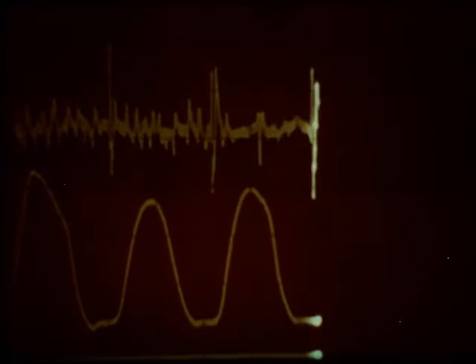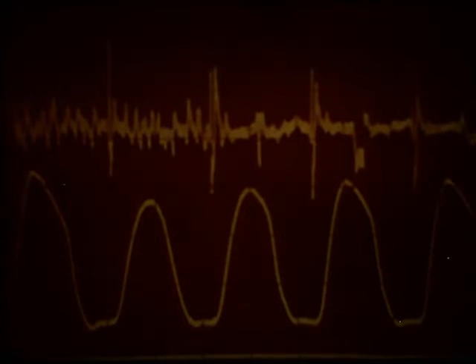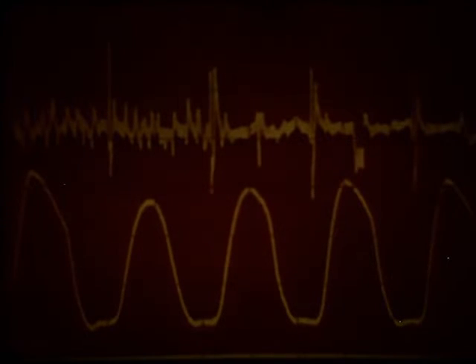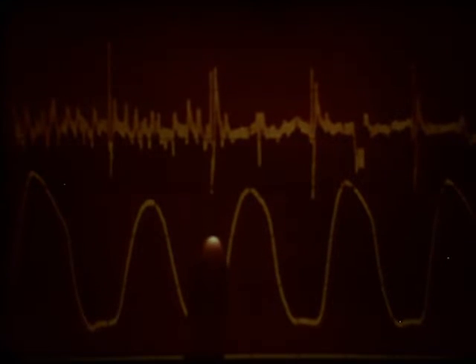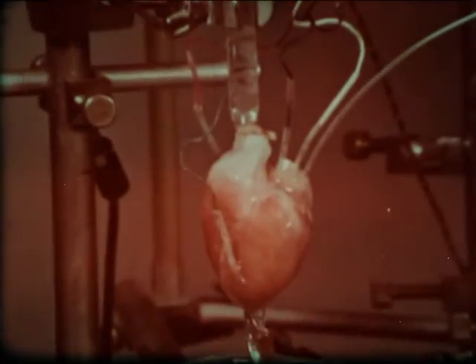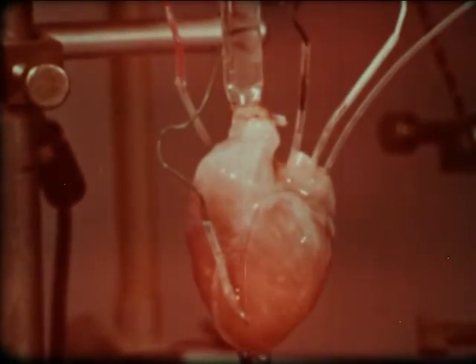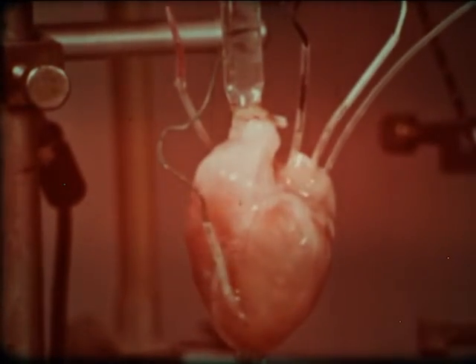Within a few moments, the atrial arrhythmia spontaneously reverted to a 1-to-1 rhythm. At this point, reversion occurred. The acetylcholine effect is almost terminated. Now the heart is stimulated electrically in order to separate the effects of acetylcholine on AV conduction from those on spontaneous rate.